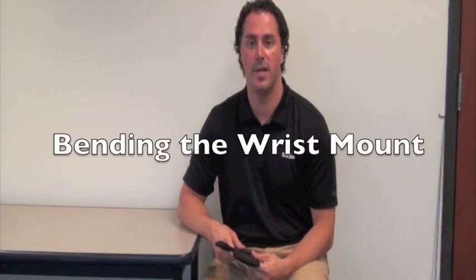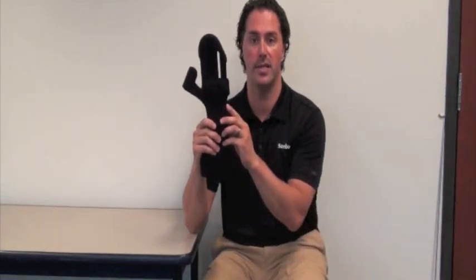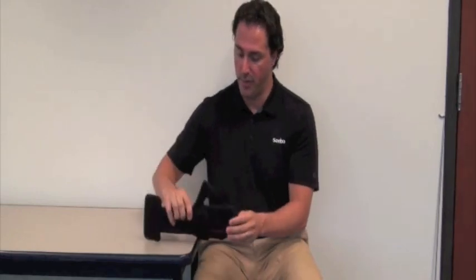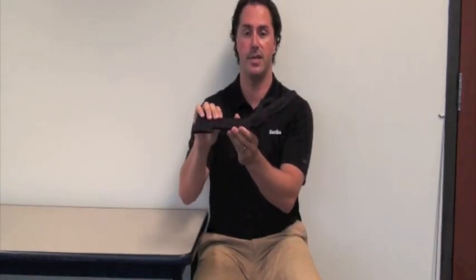Now that we've determined that Tony's wrist angle position needs to be set at plus five degrees, let's discuss the proper way of bending the wrist mount. There's a notch on the ulnar side of the splint — find an edge of the table and put the notch up against it. Put the Sabo Stretch in a flat position and bend it to the appropriate amount; in this case, five degrees of wrist extension. At this stage, we are good to go with the fitting.